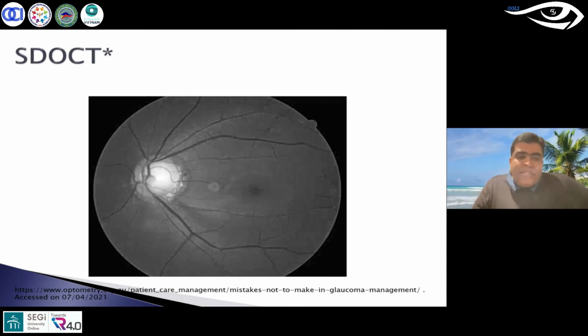So the bottom line is that irrespective of all the fancy toys or the imaging equipment that you have, your experience or clinical observation skills and the thought process that goes into the decision making of saying that this patient has glaucoma is all that matters. And never rely only on the computer generated reports, or, when in doubt, never rely only on your clinical skills. When in doubt, take a second opinion. Make sure that these equipments are used as something which helps you to provide a second opinion or further detailed understanding of the structure and function.